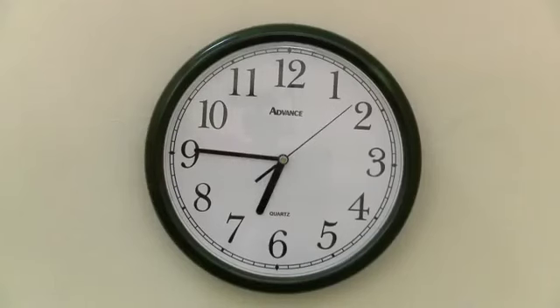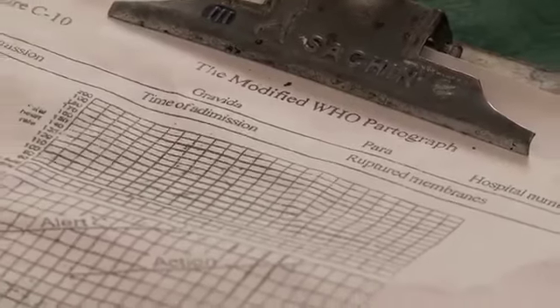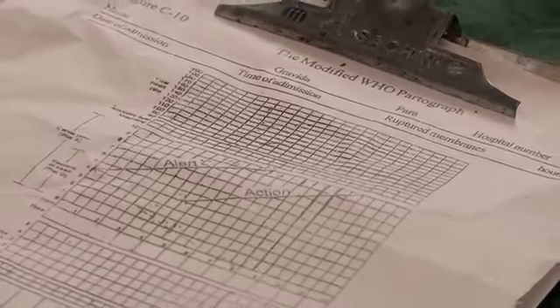Have a clock with a second hand and a wall thermometer. To monitor the labour, have a partograph and a fetoscope.